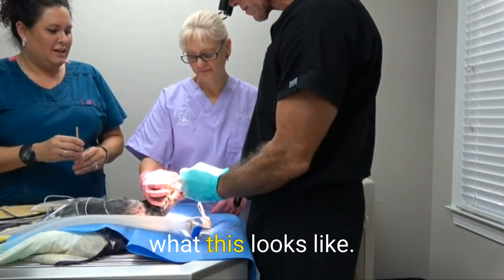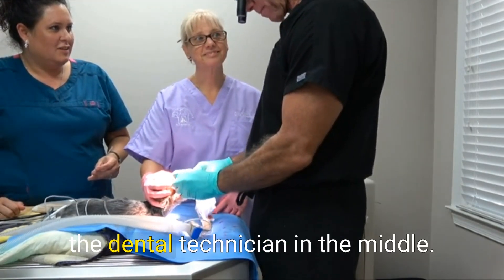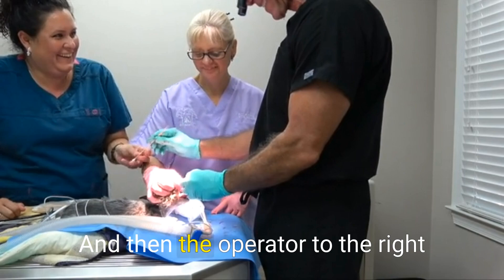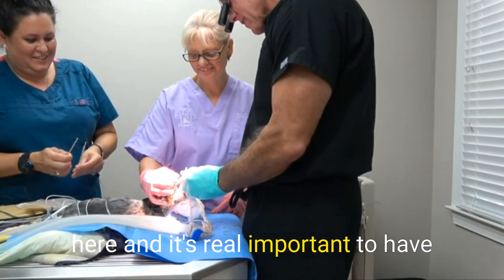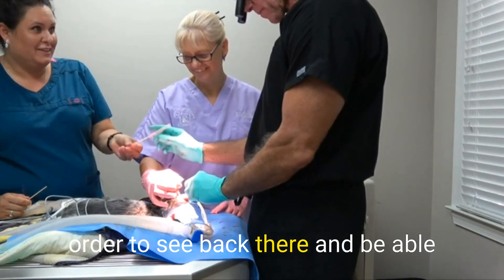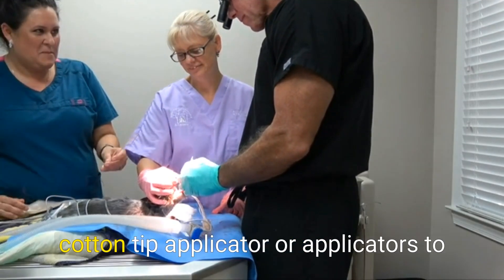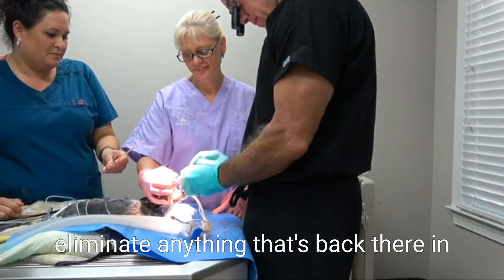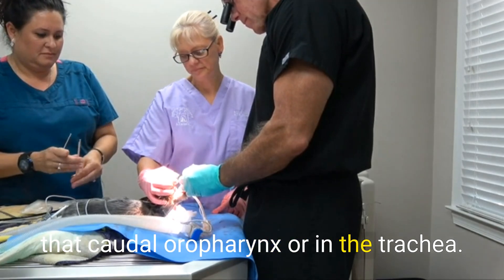Backing up, this is what this looks like: the anesthesia tech on the left, the dental technician in the middle, and the operator to the right. It's very important to have magnification and great lighting in order to see back there and fine-tune your approach with the cotton tip applicator or applicators to eliminate anything in that caudal oral pharynx or in the trachea.